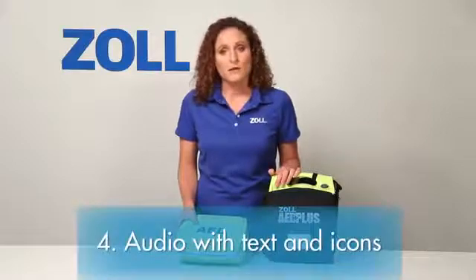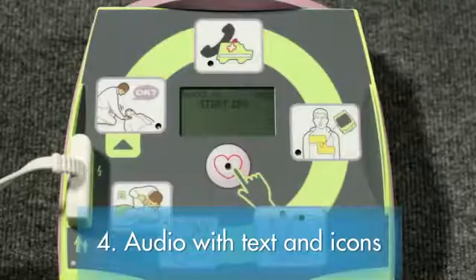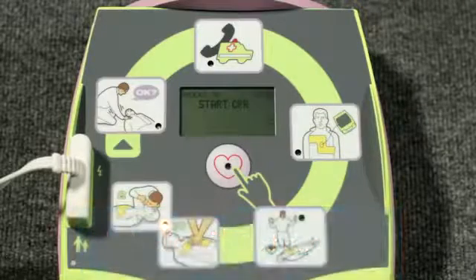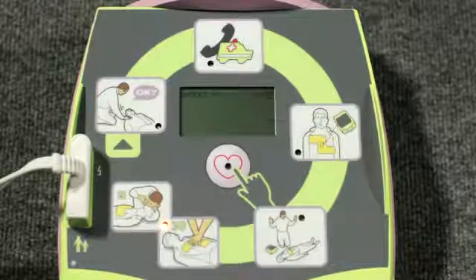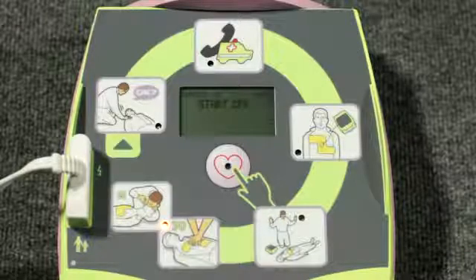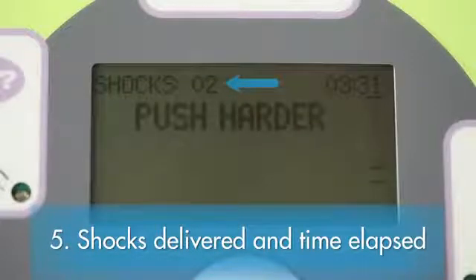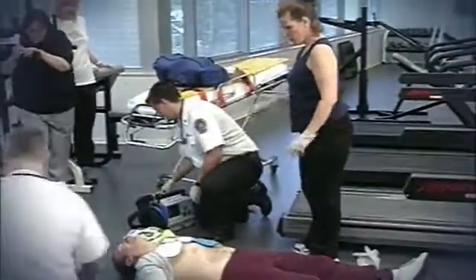The fourth element: most other AEDs do little more than provide audio prompts to guide the rescuer. The AED Plus also provides parallel text prompts and a graphical icon with flashing light for each audio prompt — rescuers are guided by what they hear and by what they see. The fifth element: at the top of the display screen, it continually presents the total number of shocks delivered and the time elapsed since it was turned on. This is most important because when the ambulance arrives, the medics will want to know both of these things, which could significantly affect what they do next.